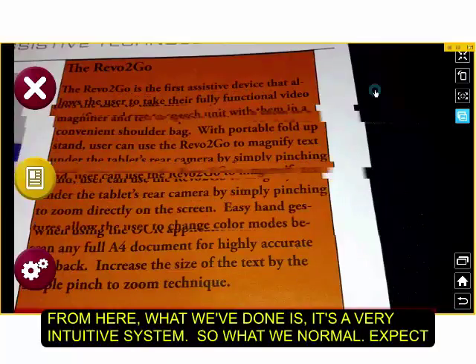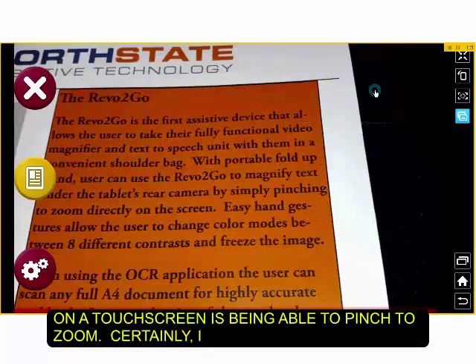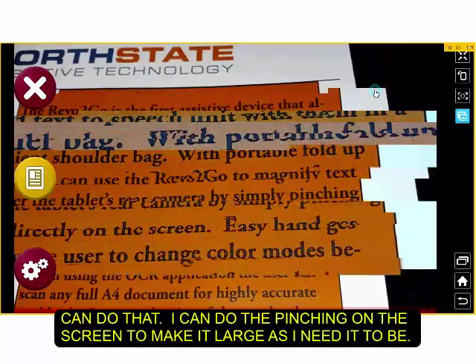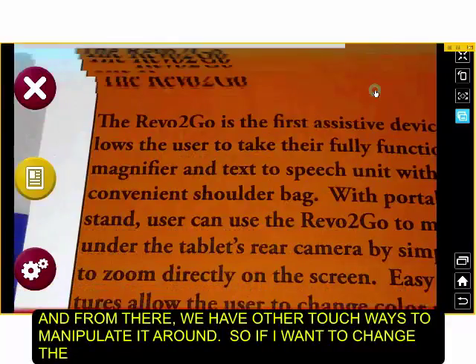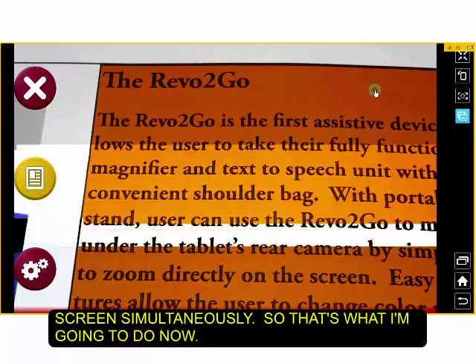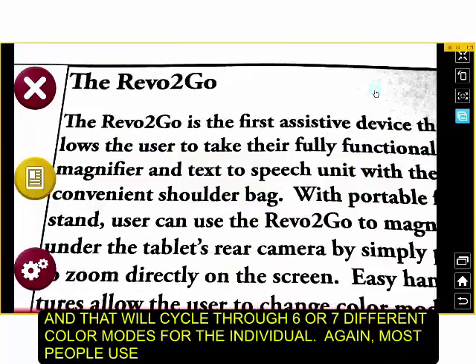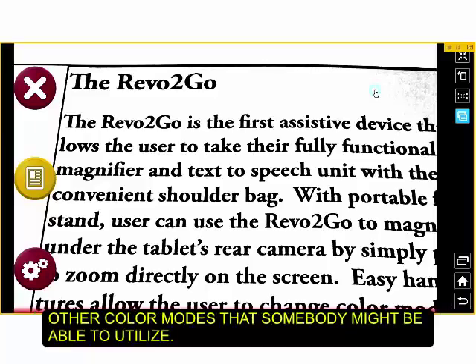From here, what we've done is it's a very intuitive system. So what we would normally expect on a touch screen is being able to pinch to zoom, and certainly I can do that, just simply pinching on the screen to make it as large as I need it to be. And then from there, we have other touch ways to manipulate it around. So if I want to change the color modes, that's actually 3 fingers touching the screen simultaneously. So that's what I'm going to do now. And that'll cycle through about 6 or 7 different color modes for the individual. Again, most people will utilize the black on white or white on black, but there are red, yellow on black, green on black, and other color modes that somebody might be able to utilize.